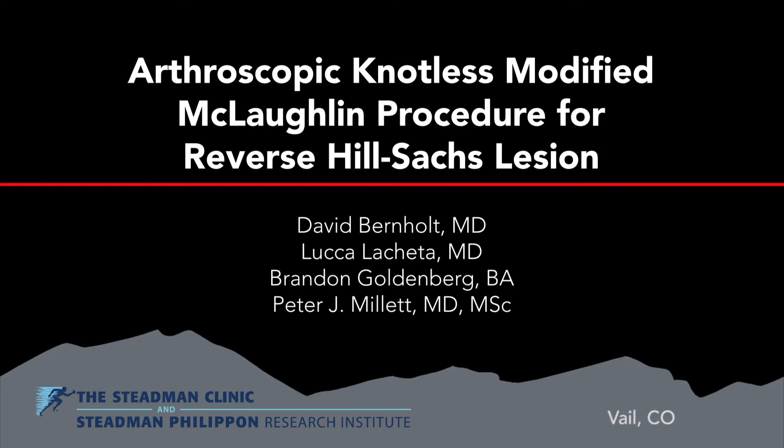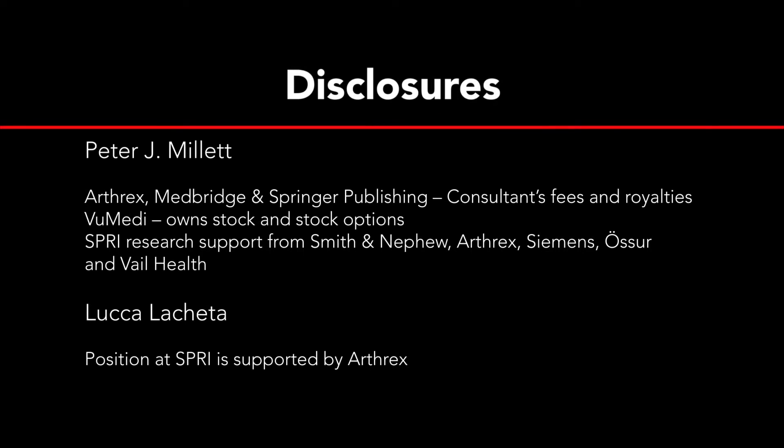This is a video presentation describing an arthroscopic knotless modified McLaughlin procedure for a reverse Hill-Sachs lesion.